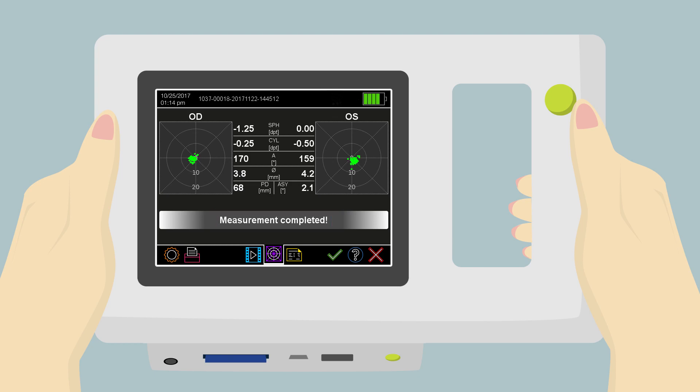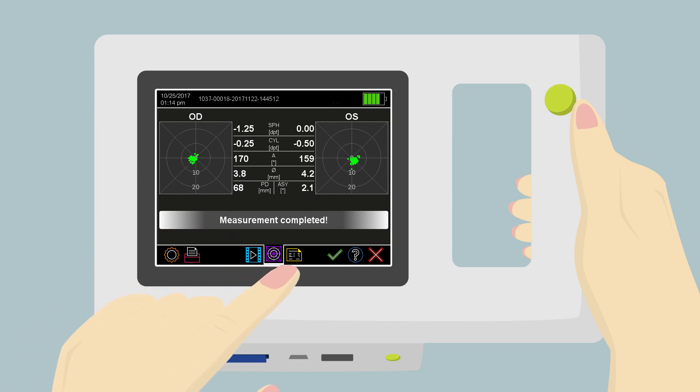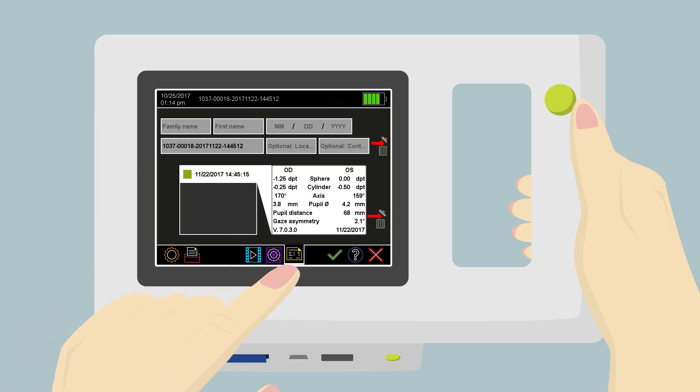You can move through the measurement result pages by choosing one of these three buttons displayed in the navigation bar.